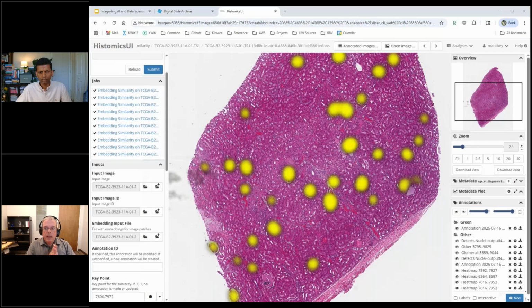And yes, so that is how you can run this outside of it. We have several points of documentation. Because of the way open standards work, this is a bit scattered. So we have one page trying to be the landing of here's everything you need to know to package one of these. And it can be very simple, like literally if you have a command line tool that you can run, it should be straightforward to package. There's a little bit of complexity to make sure you get the data types right. And then once you have it that way, it still can just be run as a command line tool or dropped into this.